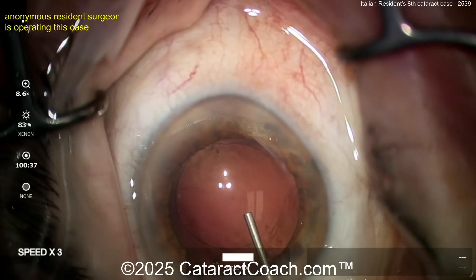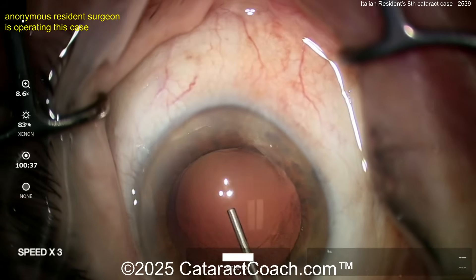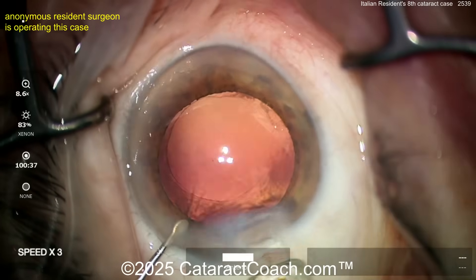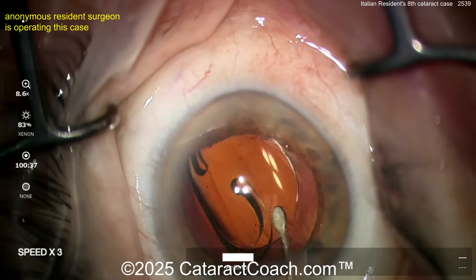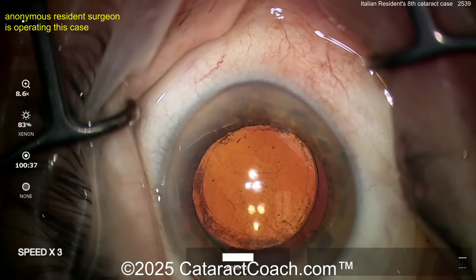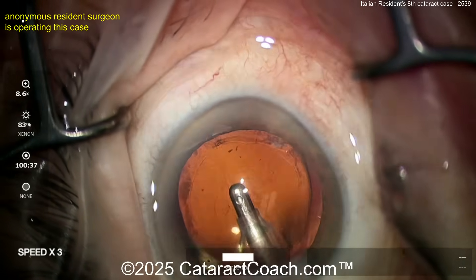Keep the eye in primary the whole case — that is very important. And by the way, next time could you turn off the screen overlay? Do I really need to know what percentage your light beam is? It makes no sense to me — turn off that screen overlay. You can turn it off on this microscope. Now, here comes the lens going into the capsular bag — I like that, going in beautifully. Let's see the rhexis at the end here — see the overlap. You've clearly practiced in a lab. That's a beautiful rhexis, about five millimeters — that looks fantastic.